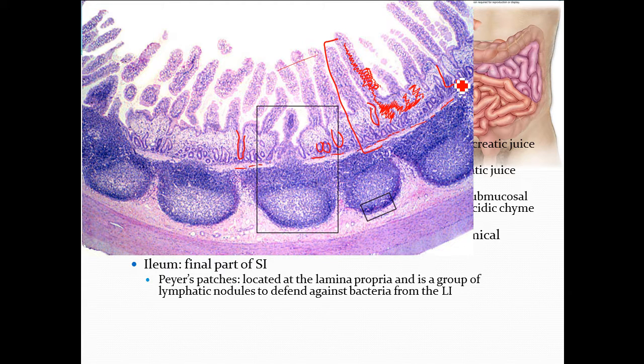Okay, it's not pits because we're in the... What organ are we in again? Okay, this is the intestine. So... No, the goblet cells you'll see within the columnar epithelium. So these lightly stained or non-staining structures that you see here are the goblet cells.